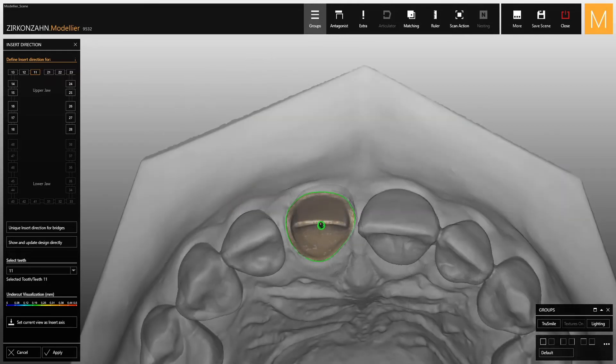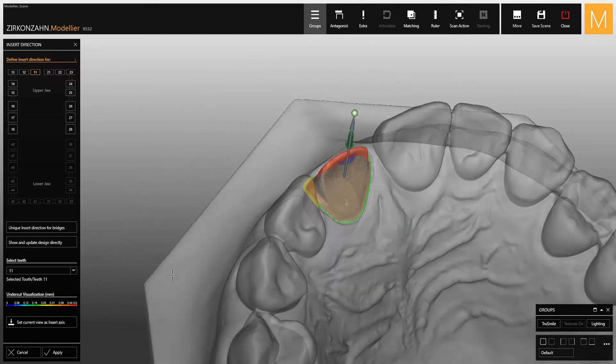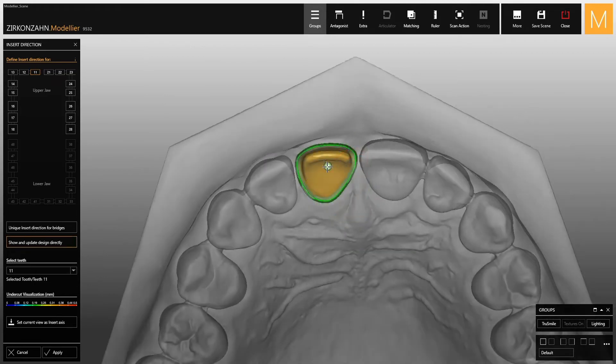While setting the insert direction, if you select the highlighted option on the left, you can view and update the crown base in real-time.